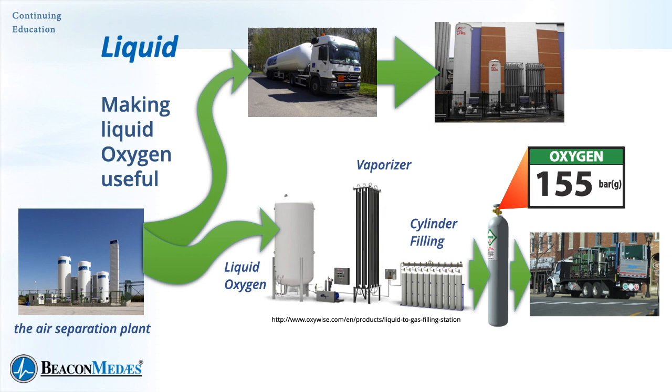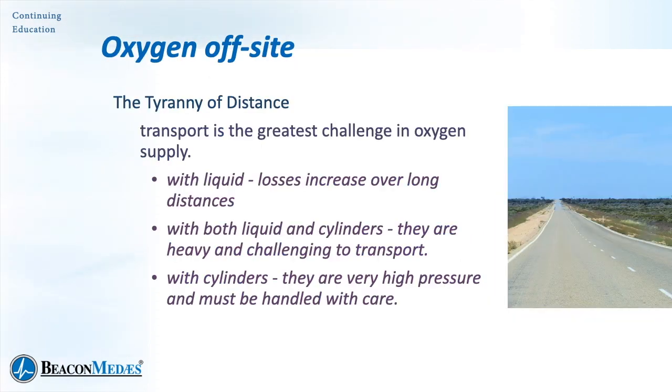We're going to have to transport it to site. And that's where the tyranny of distance comes in. Transportation is the biggest challenge in all oxygen supply questions. With liquid, we can only store it so long, we can only transport it so far because it's a use it or lose it situation. Liquid oxygen will gradually boil off, and we're going to lose some oxygen as we transport it.